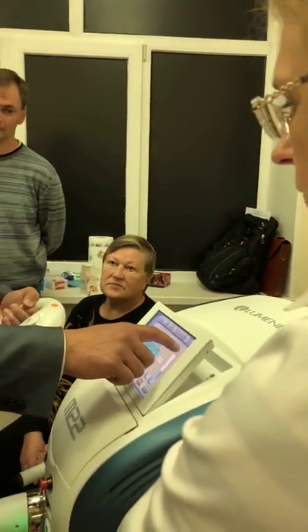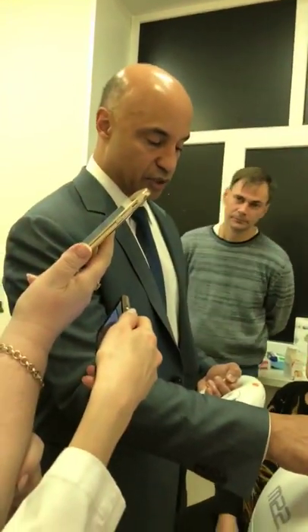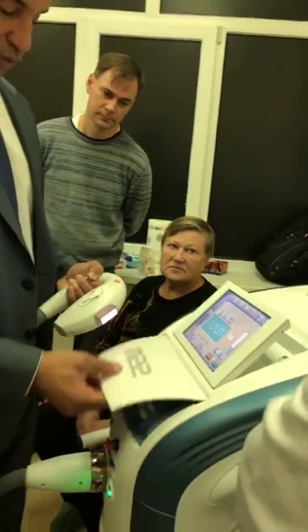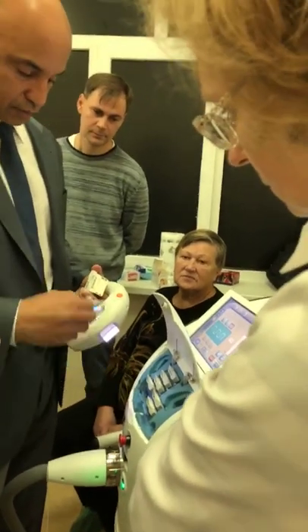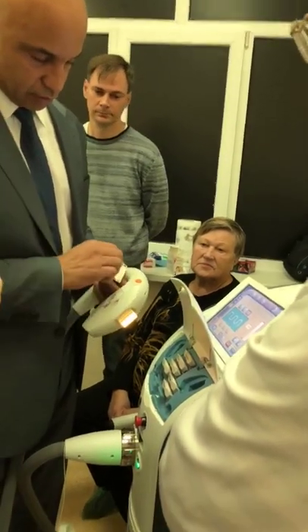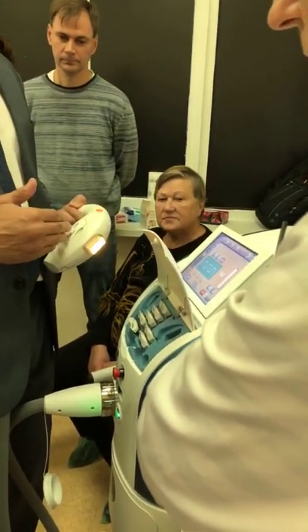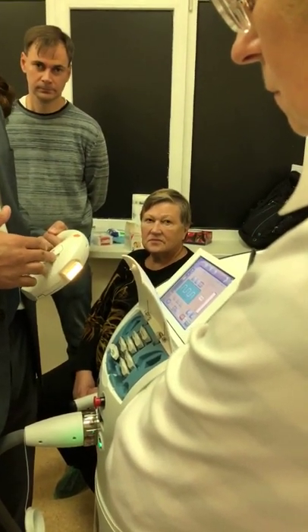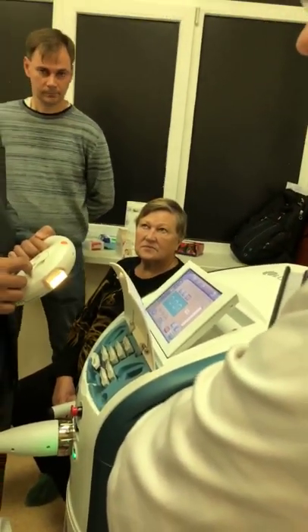Then the other thing is you can control the filter. So right now this has a 755 nanometer filter. We don't want that. Remember we said we wanted the reds. We want 600 to 700. So what we're going to do is we're going to change the filter. Можно менять еще фильтры. to a 590 filter. So what the 590 filter means is that any energy level lower than 590 will be blocked by this filter, and it'll allow anything above 590 to come through. And that's what we want. We want that 600 to 700 nanometers of energy.